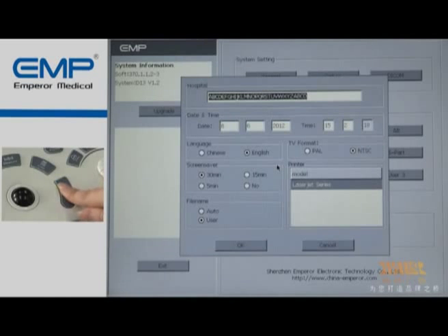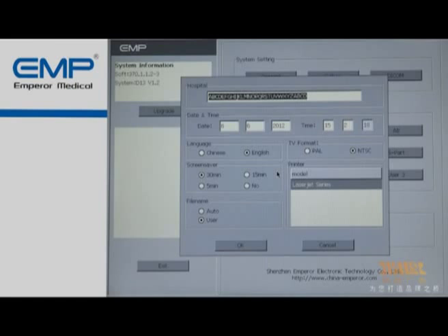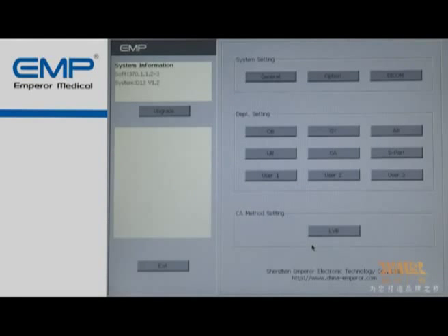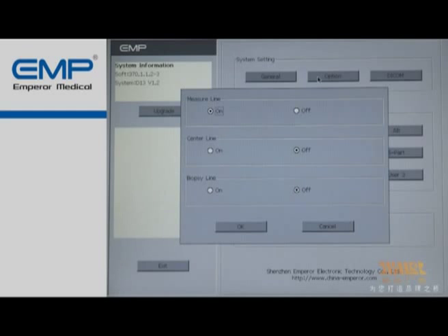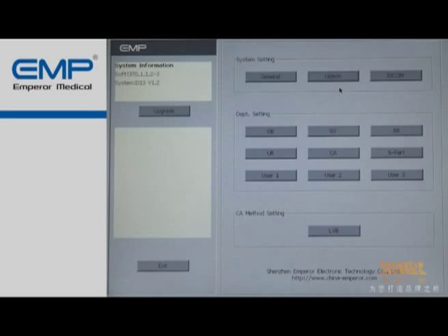In general settings, the user can input the name of the hospital, date and time, language, printer setting, and file name method. In option settings, the user can turn on or off the measure line, center line, and biopsy line. Also, they can choose the zoom mode under B mode, partial zoom or picture-in-picture.